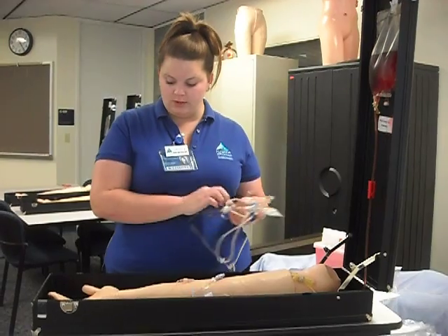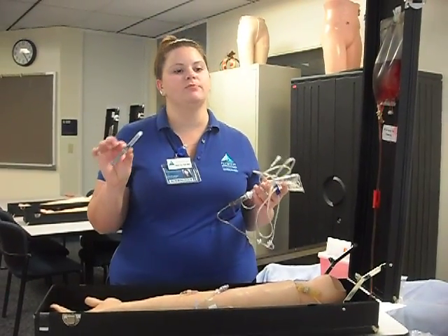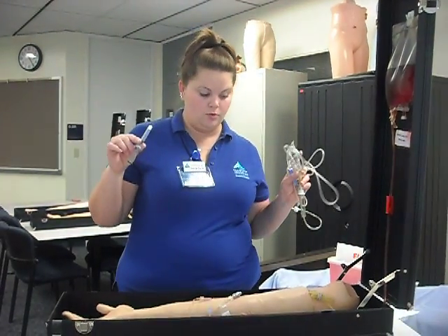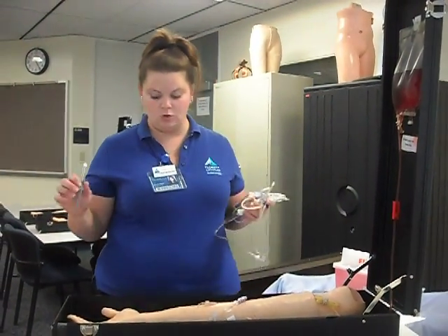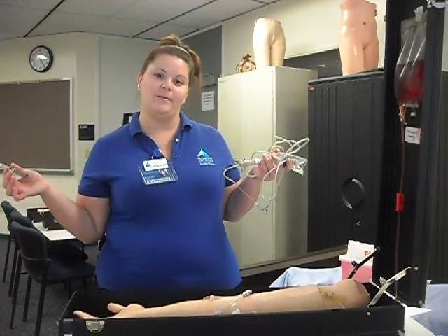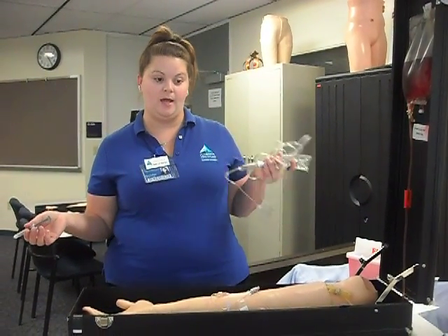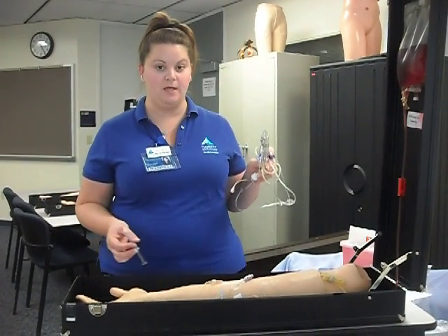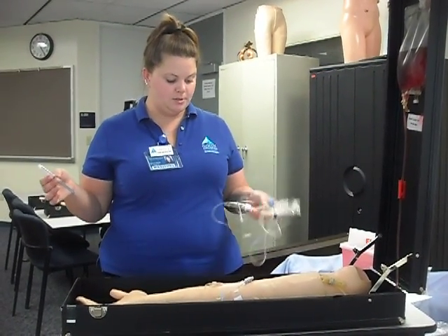And I am going to also bring with me some pre-filled syringes full of saline. And I am going to go to the patient's room. So I'm going to knock on the door. Hi, it's Dot. I'm going to be your nurse today, and the doctor has ordered some medication to run through your IV.